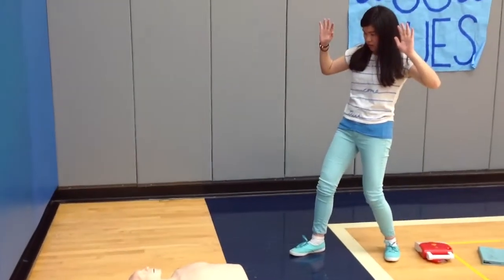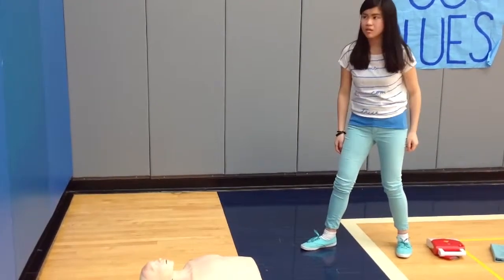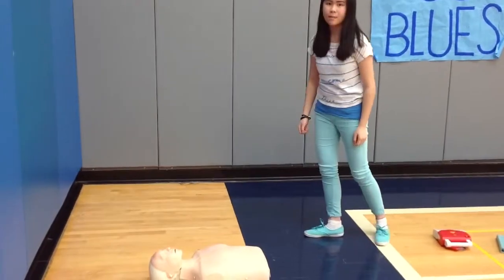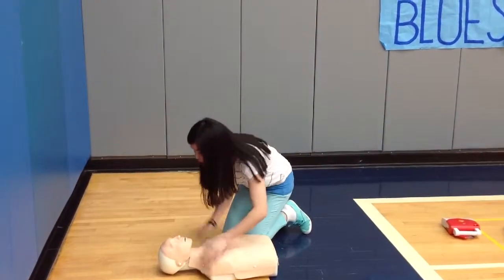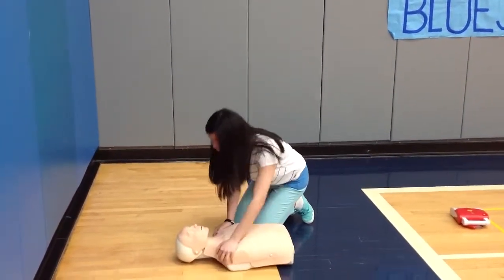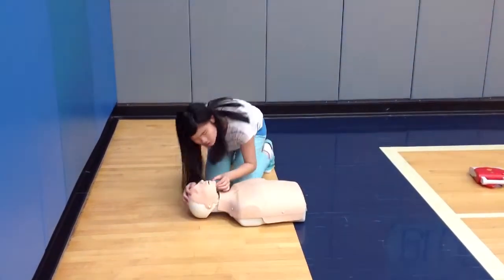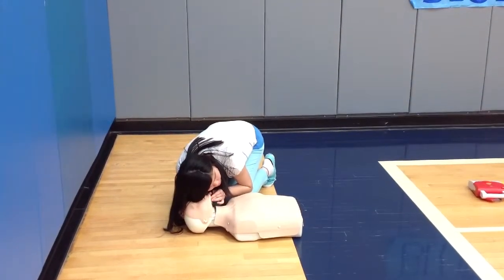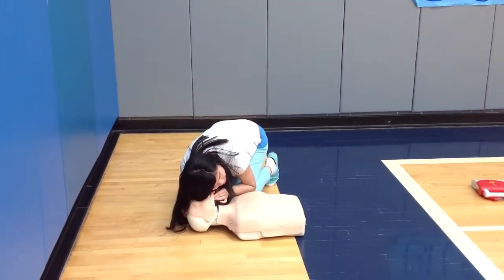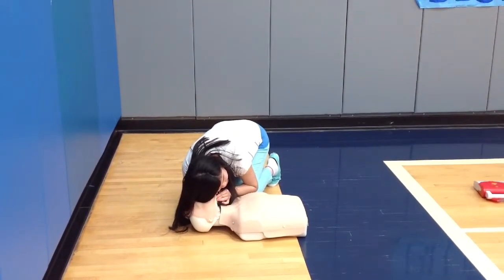First, before you perform any care, you need to check and see if the scene is safe. Once you've scanned the scene and seen that you are not in danger, you can go over to the person and check and see if they are conscious. Miss Robb, are you okay? If they appear to be unconscious, you should listen for breathing for 10 whole seconds. 3, 4, 5, 6, 7, 8, 9, 10.